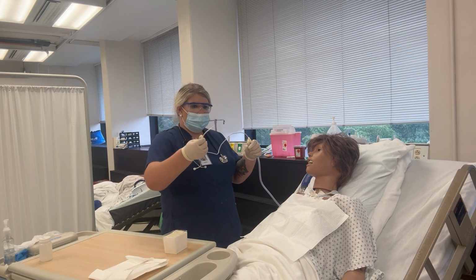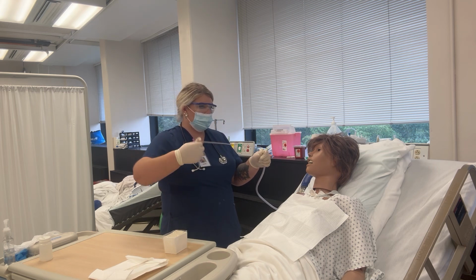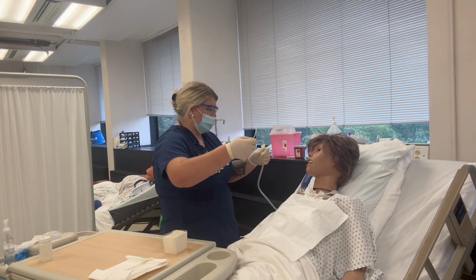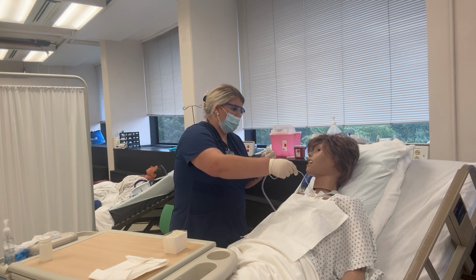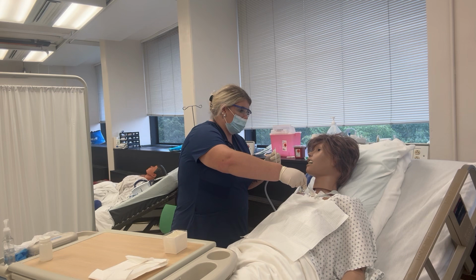So we're going to go ahead and insert into the catheter, or the trachea. Get a good hand placement here. When inserting, you always want to make sure that you do not have your finger over top so that we are not suctioning when inserting. We're going to go ahead and insert. When inserting, you want to go in until you meet resistance or cough.